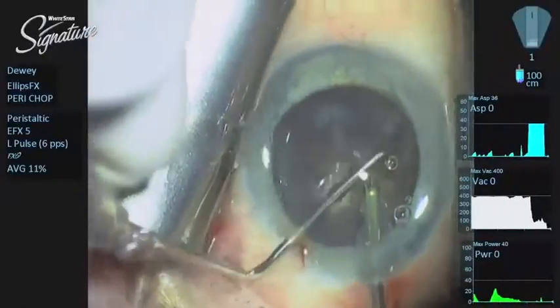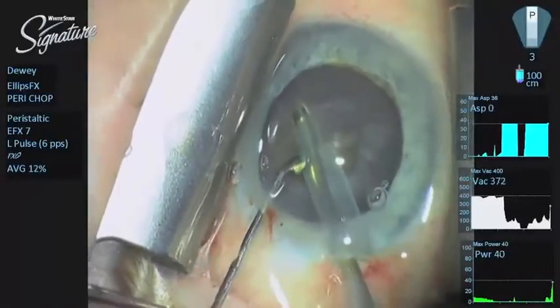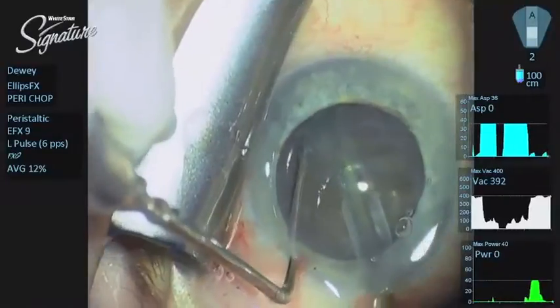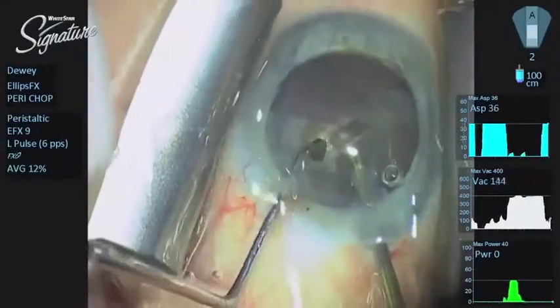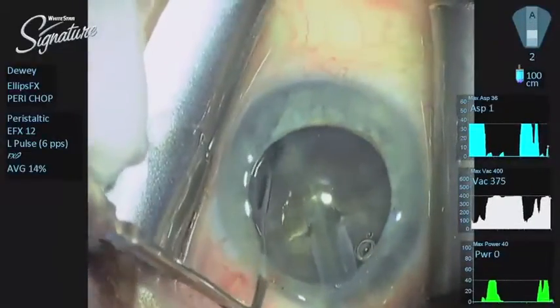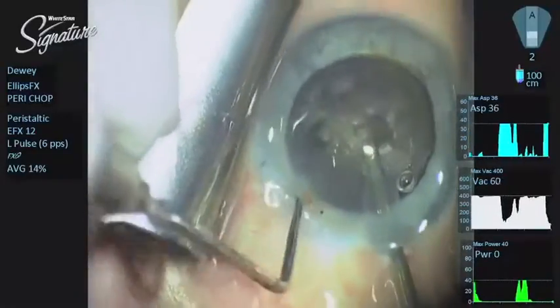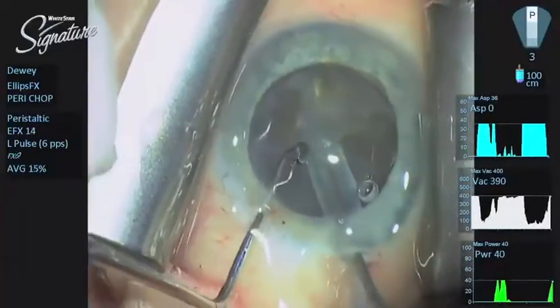The power of transversal is amazing. This is the Dewey Radius tip — it is a 700 micron needle with a 21 gauge internal diameter, so it is beneficially a smaller needle. The outside of the needle is functionally a 22 gauge, the inside is functionally a 21 gauge. So you have the advantage of preserving the smaller incision with the benefits of having the larger internal diameter fluidics.